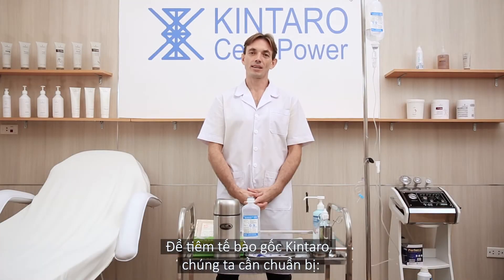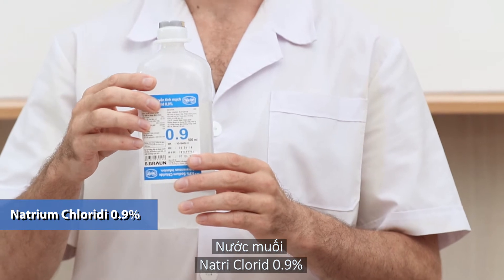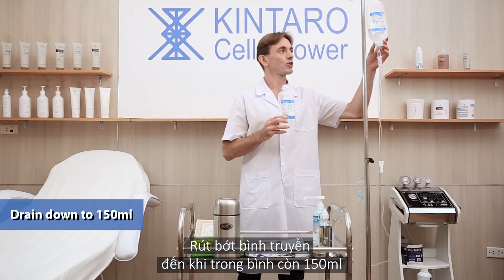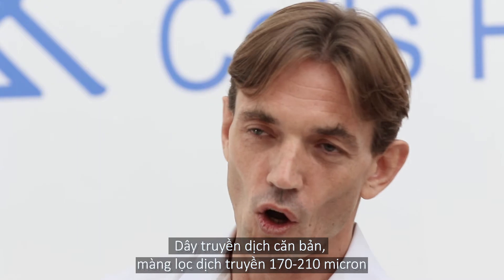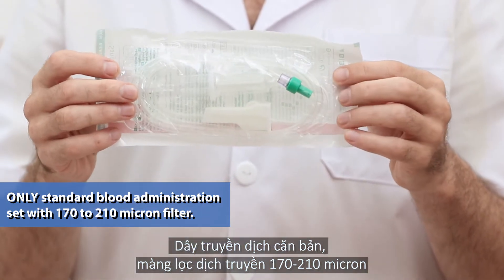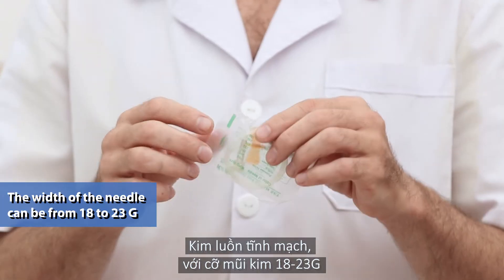To administer Kintaro cells, we prepare isotonic saline Natrium Chloride 0.9%, drain down to 150 milliliters only. We use a standard blood administration set with a filter from 170 to 210 microns, and a venous catheter.